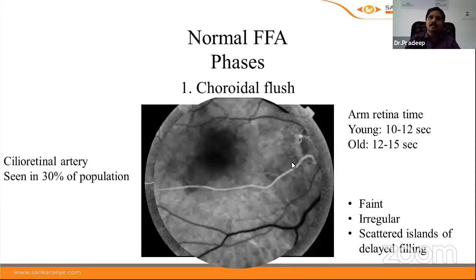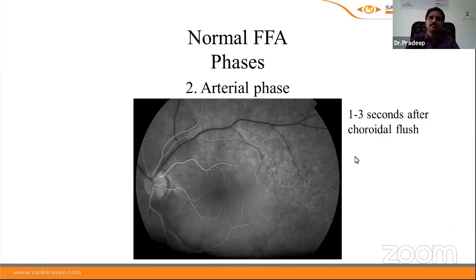The cilioretinal artery is a branch of the ciliary artery supplying the retina, arising from the choroidal vessels, so it fills in the choroidal phase. It is seen in around 30% of the population. The second phase is the arterial phase, characterized by filling of retinal arteries while the retinal veins still show hypofluorescence. It usually occurs 1–3 seconds after the choroidal flush.